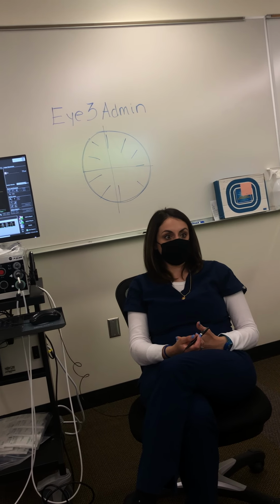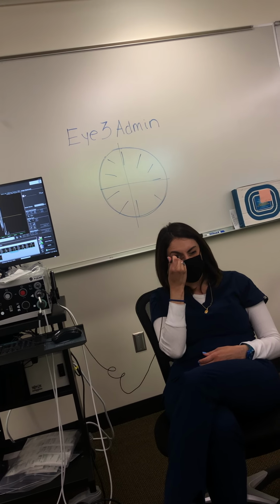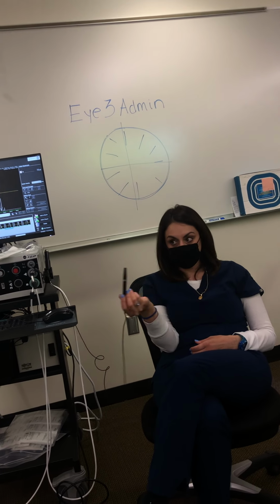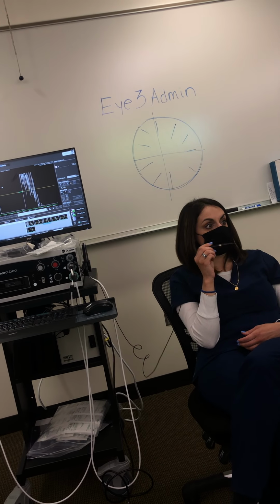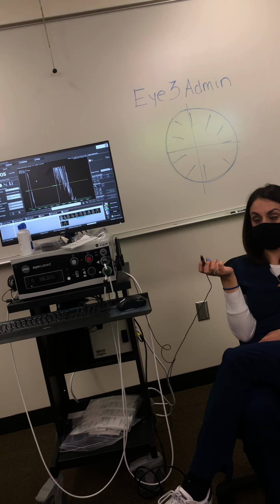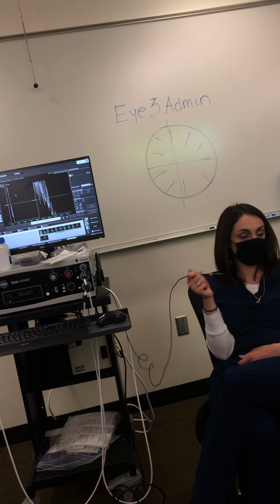So it's not like I'm looking cross-eyed. The whole thing is the red light because it's so close. And if you bring this close enough to your own eye, you'll see what I mean. So if they have vision in the other eye, with the other eye, just look straight ahead. Sometimes if they have an eccentric gaze, it's not even worth telling them to look anywhere. You've gotta adjust yourself.